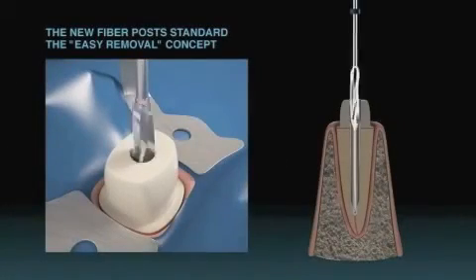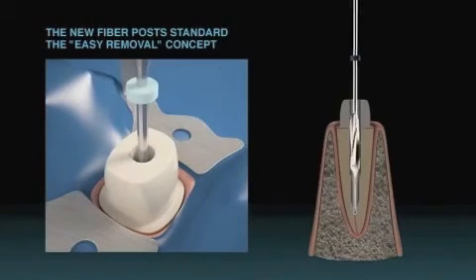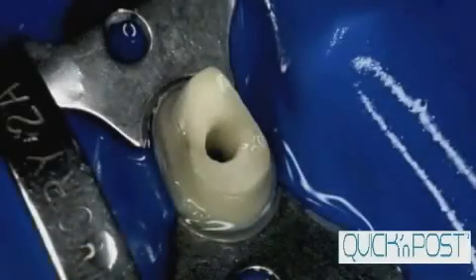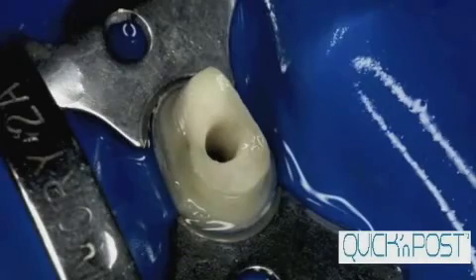At this point, the removal of the post from the canal space can be said to be finished, rapidly, safely, and without sacrificing healthy dental tissue. The dentist can now proceed with the retreatment of the canal and resolve the endodontic problems.